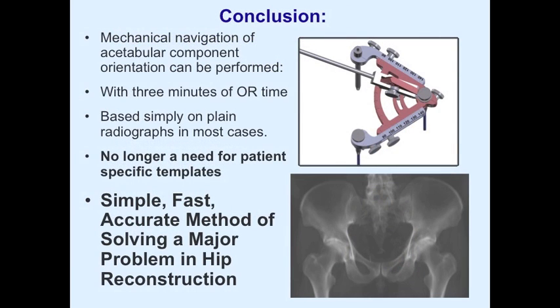So we're working on a mechanical navigation instrument where we can accurately perform component orientation within 3 minutes of OR time, based either on CT or on plain radiographs. And so we're trying to make more progress in a simple, fast, and accurate way of solving one of the biggest problems in hip arthroplasty.